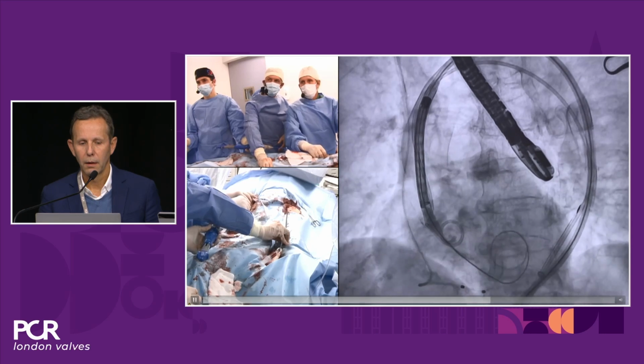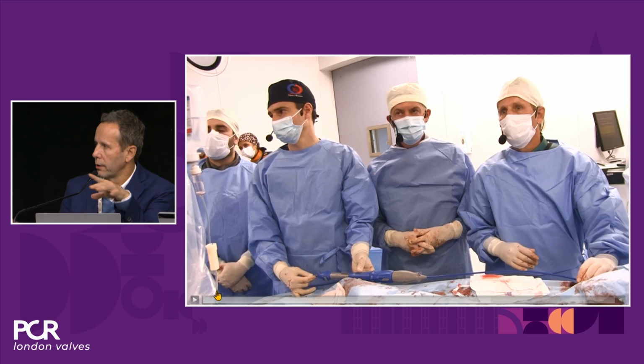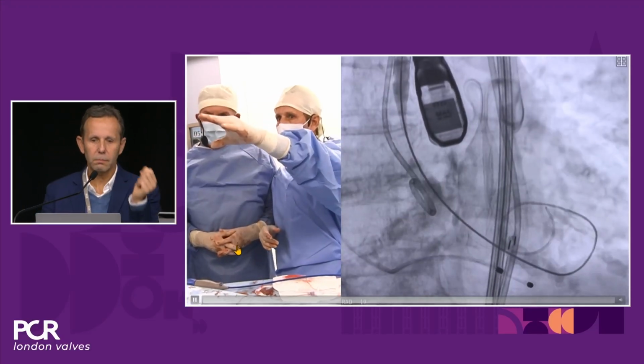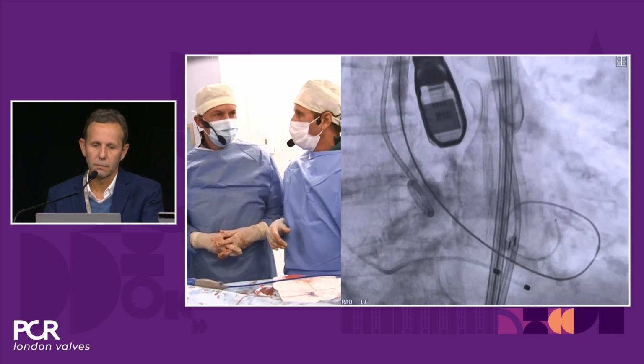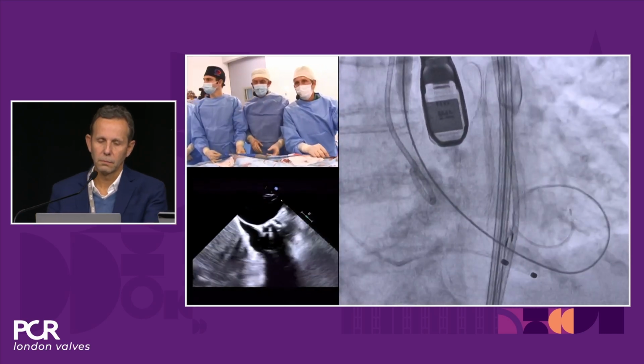I think we're good. And this is the valve that has the most potential to interact because the tip is more rigid. So for the other, for example, a balloon expandable SAPIEN valve, we saw even less interaction with the valve and the Emboliner. So this is an example that it works really well. So now, Alex, we're going to rely on the pigtail, the base of the pigtail that is in the non-coronary cusp, calcium markers, and also TEE will show us the depth of implantation. Yes, that's going to show us the value of echo to guide this procedure.